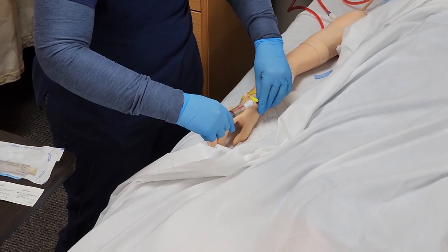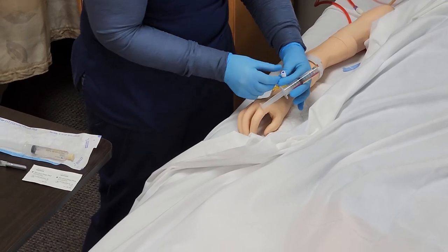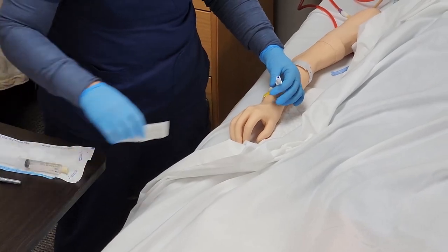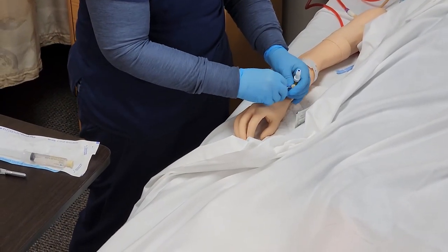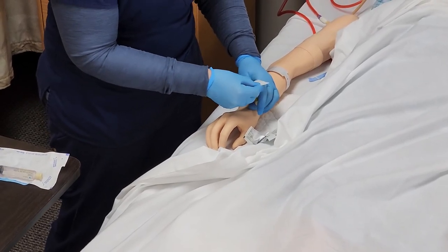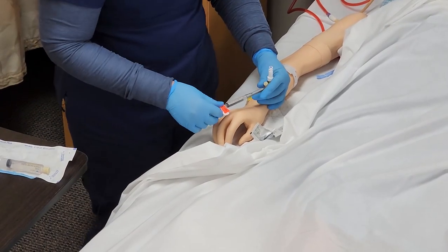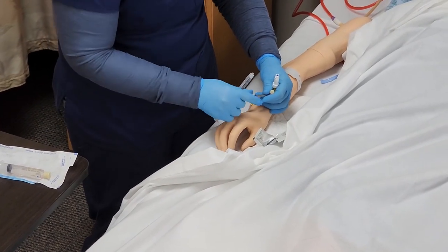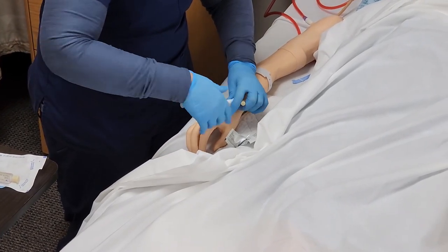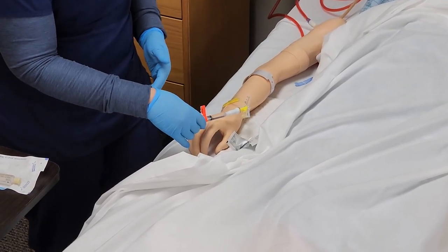Then I'm going to clamp, remove, and discard this flush, then disinfect again for five seconds in between. When I flushed, I could tell it flushed well — there was no resistance — so the IV is patent and the site still looks very good.